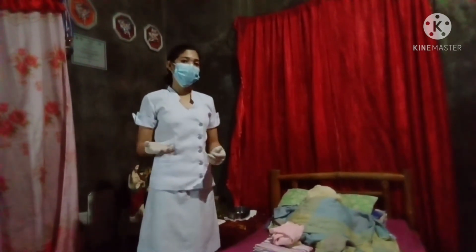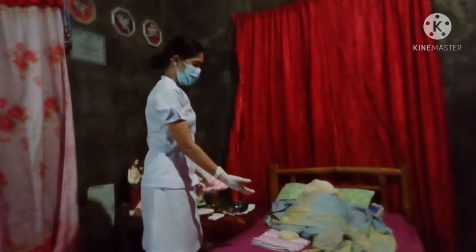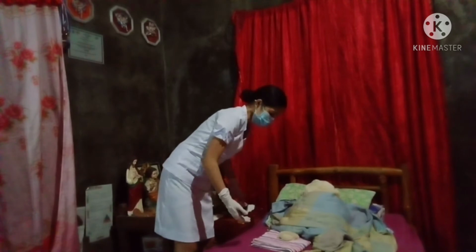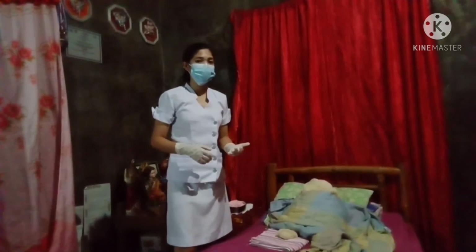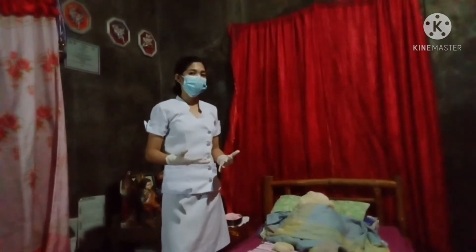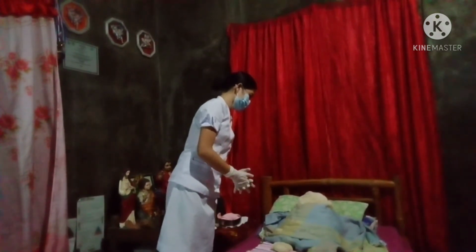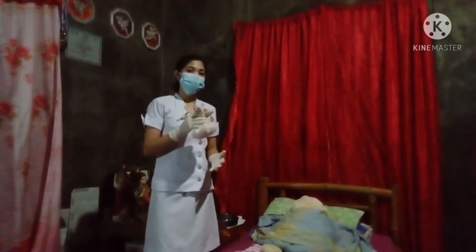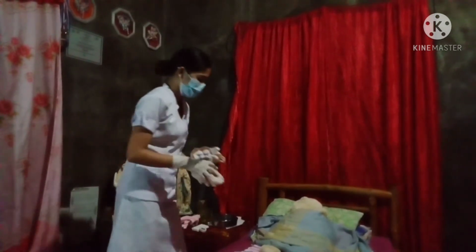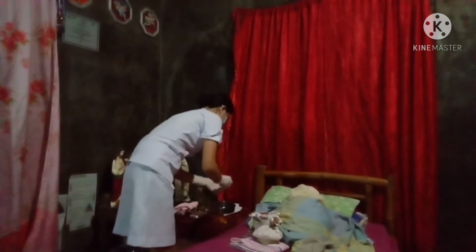After 30 seconds, we have to remove the ice and assess the site for redness. Also, ask the patient about a burning sensation to prevent burn injury. Do you feel any burning sensation? Replace the device snugly onto the site if no problems are evident. And secure it in place with gauze wrap or tape. Wrapping and taping stabilizes the device in proper location. So, this is our tape.